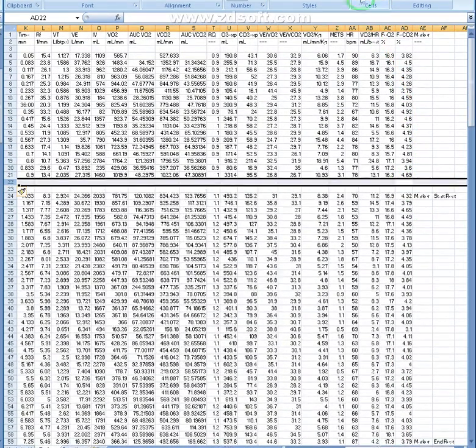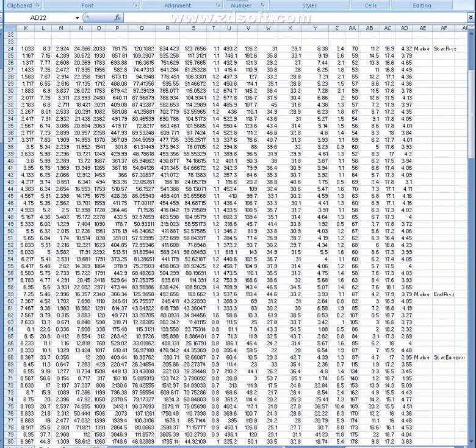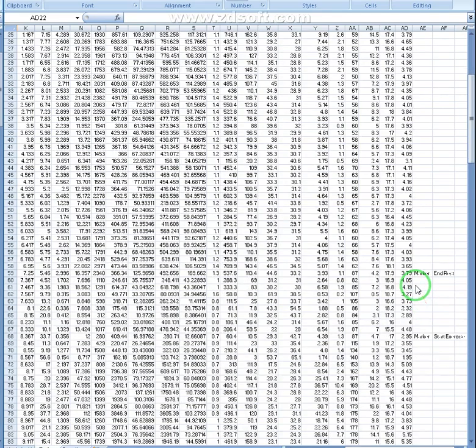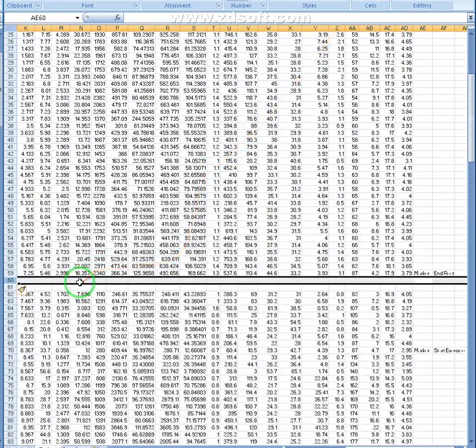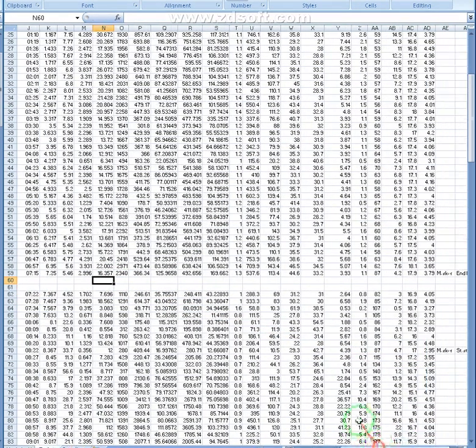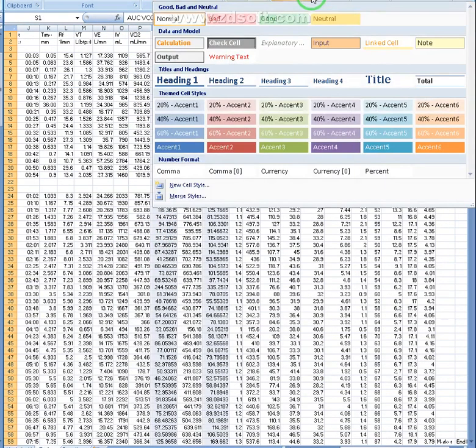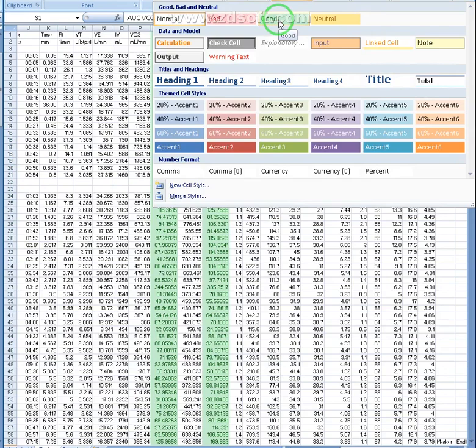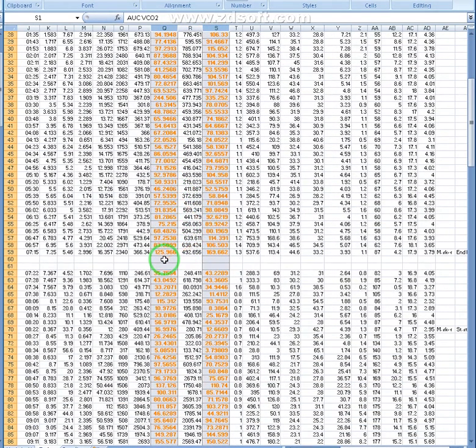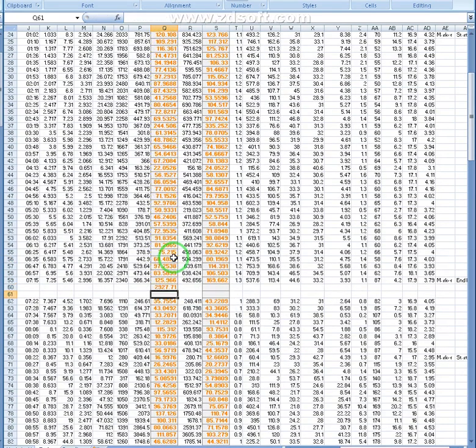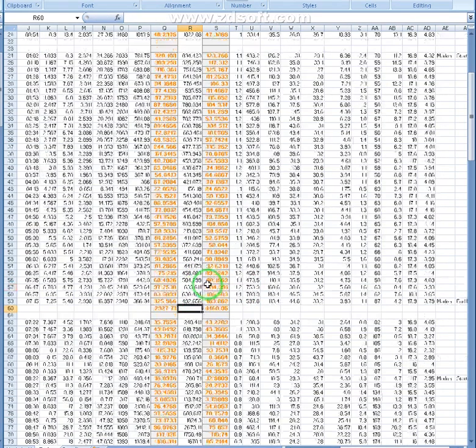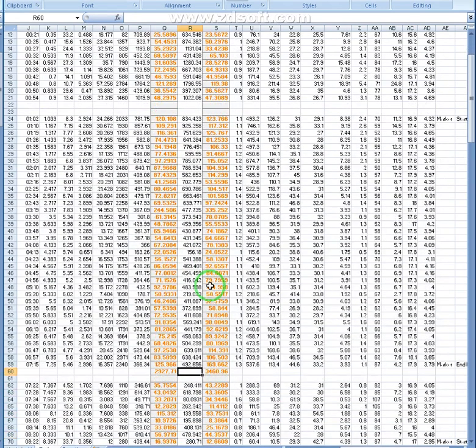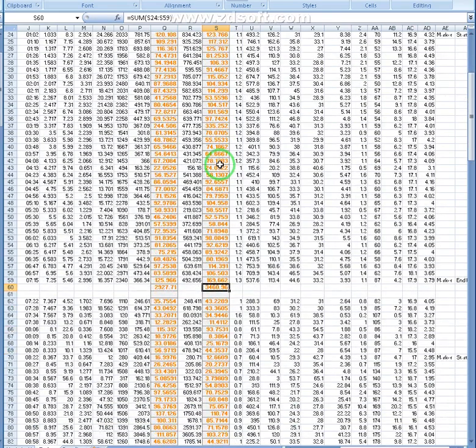So we are just interested in these intervals when we get to them. So our first one is rest. How much oxygen, CO2, did they have during rest? To make this just a little bit easier, I'm going to do a different kind of style for these two columns. I'm going to do this just so it's easier for me to tell and I don't have to scroll up all the time or remember that this is even Q. So I'm going to do the sum right here, and also the sum here. That tells me how much oxygen and how much CO2 that this person used during those six minutes of rest. And this was sitting rest for our purposes.